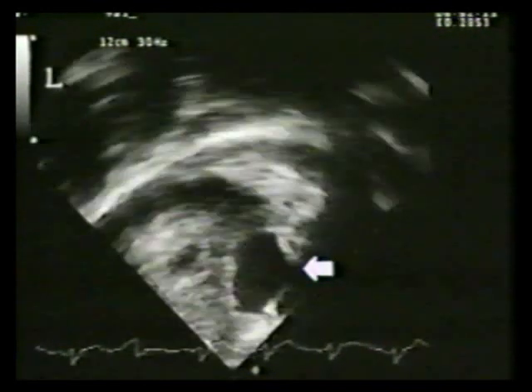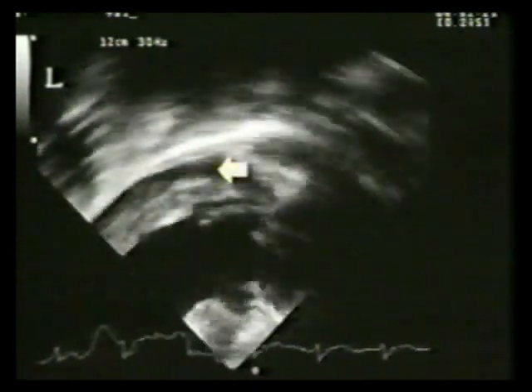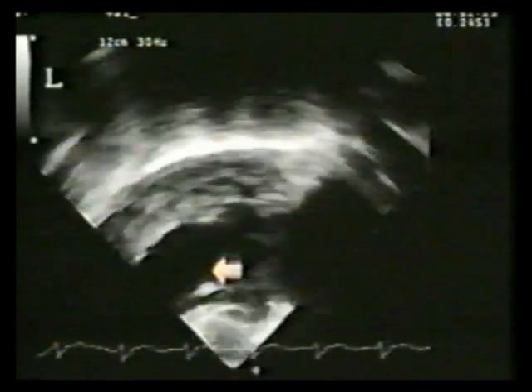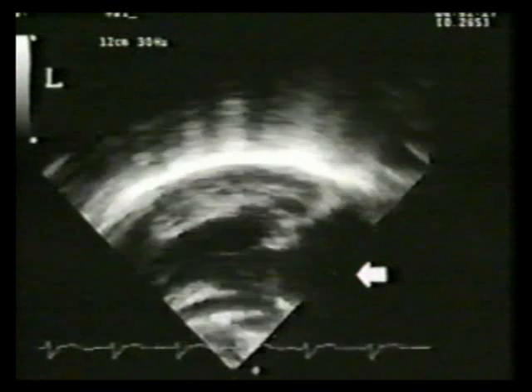In the long axis projection or longitudinal view, the transducer is posterior to the posterior wall of left ventricle. The mitral apparatus and its support are visualized in long axis. The anterior wall and posterior wall are respectively visualized along with left atrial cavity.